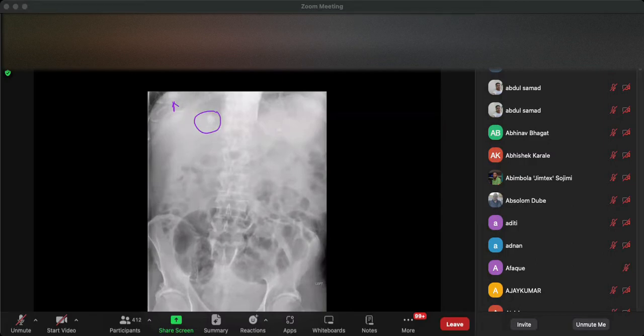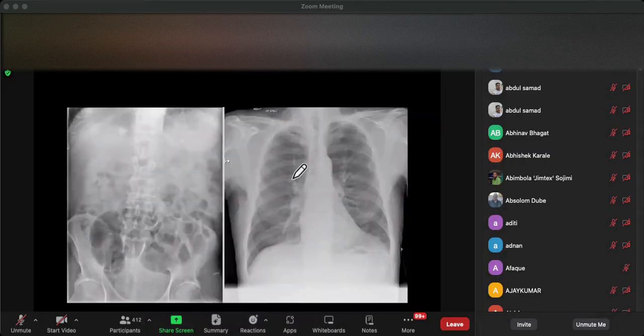Now, it may be tricky to see, but this patient has got lung nodules projected at the base. And when you do the chest x-ray, you can see there's one there. There's obviously the one that you could see here. There's one just there, quite difficult to see, but that's a definite lung nodule. So we've seen more than one lung nodule, 1, 2, 3, 4. And so this is pulmonary metastases.